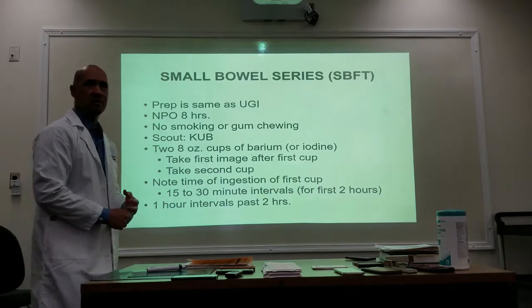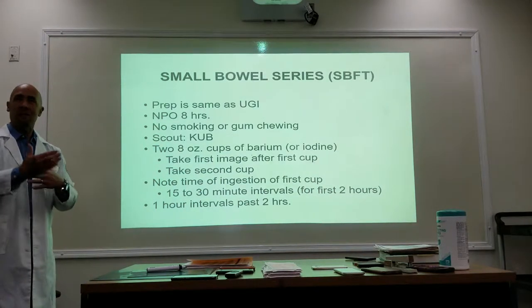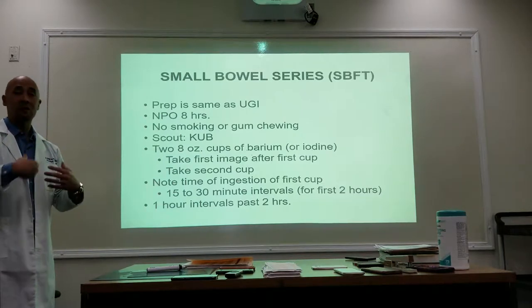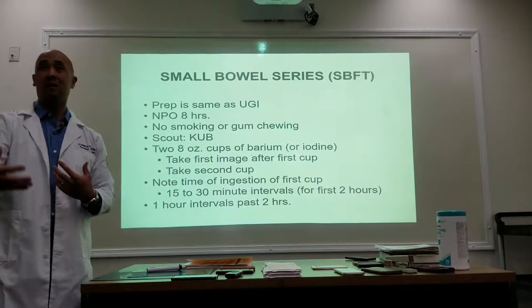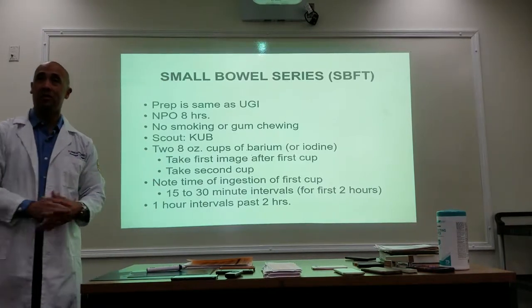Why are we timing this? What's the purpose of timing these shots? Because again, there's an average time that the contrast should go through the bowels, and if it's taking a little bit longer, again, it's indicative of something else going on. And that's why we time these images.